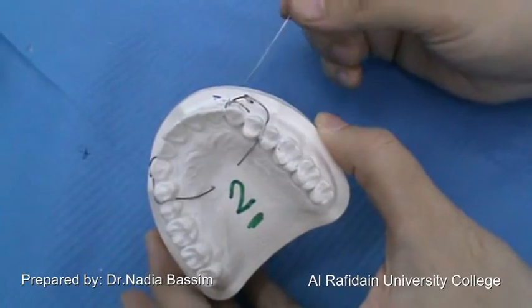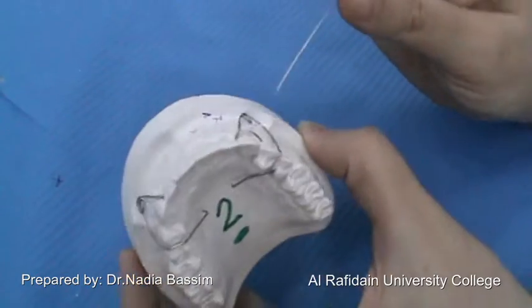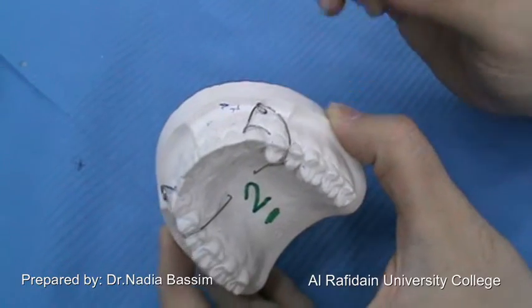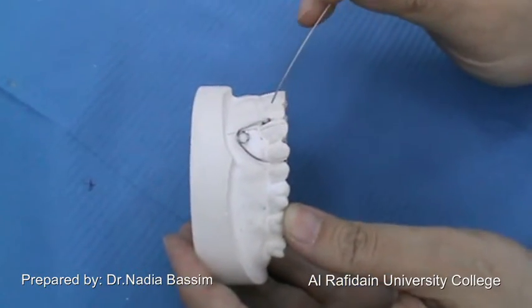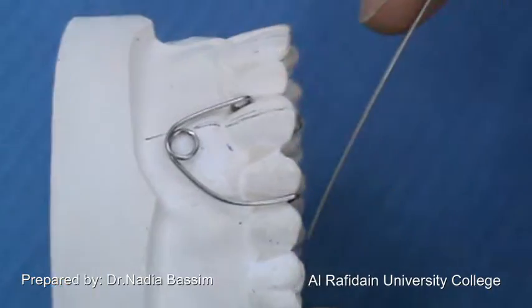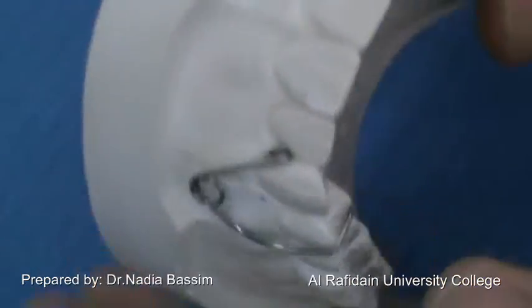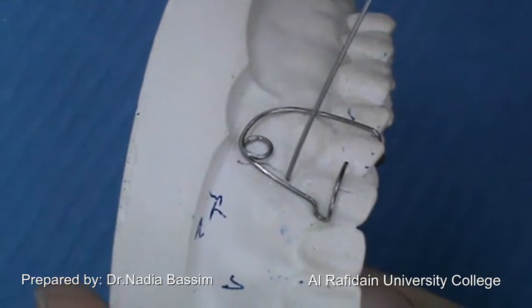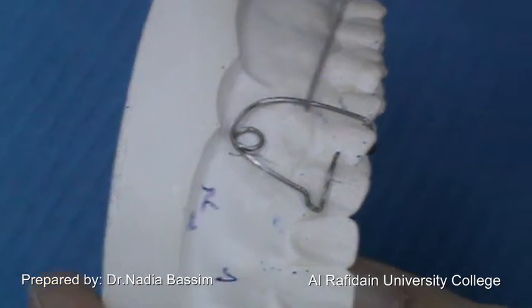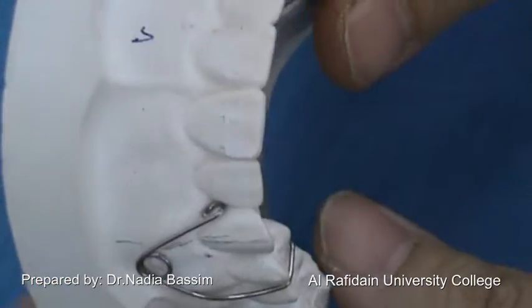This lab demonstration is about the buccal canine retractor. It has two types: the simple and the modified buccal canine retractor. It is used for distal movement of a mesially inclined canine. If it was within the line of occlusion, we use the simple BCR. If it was buccally and mesially inclined and buccally malposed, we use the modified BCR. We are now going to learn the main difference between these two types.